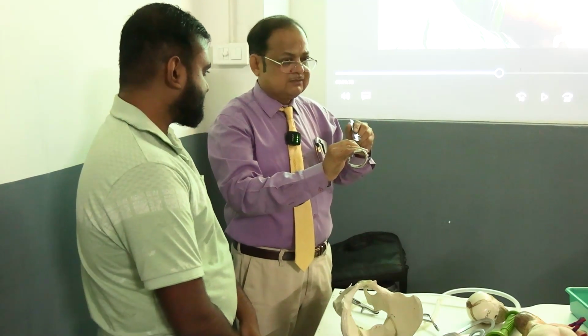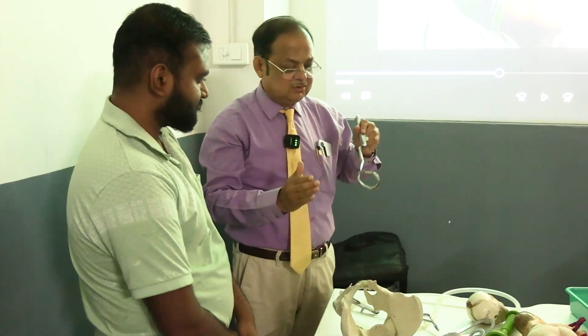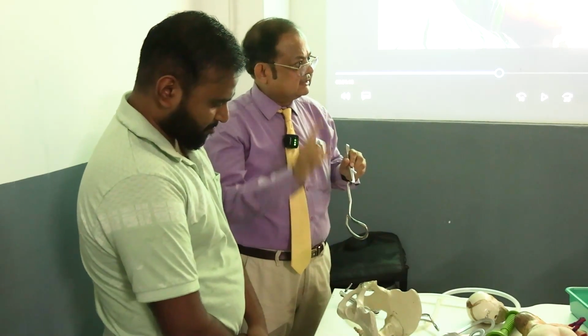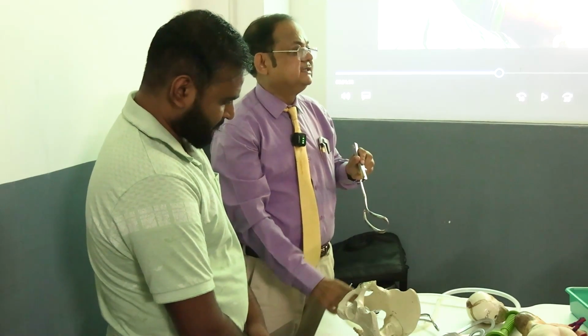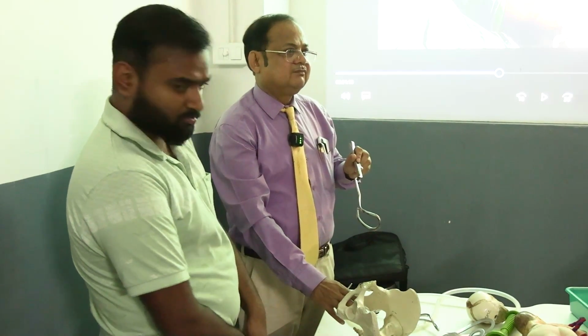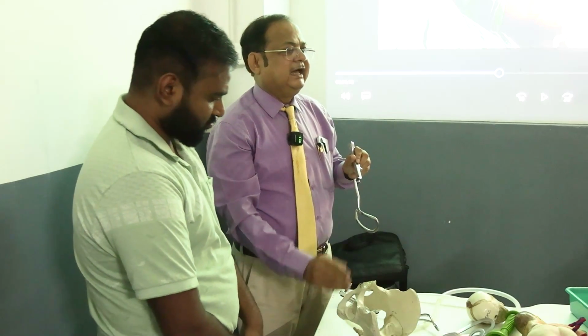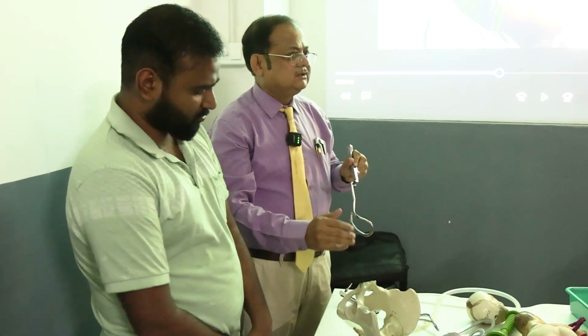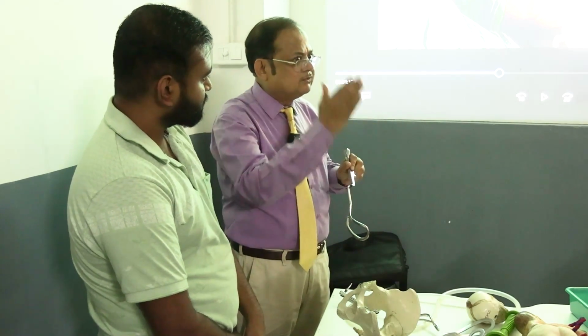Then in case of low forceps operation, what will you do? Antiseptic dressing, draping, catheterization, and on PV examination, you will see whether criteria are fulfilled: full dilatation, head is low down, and whether you will give the low forceps or the outlet forceps, and the position.